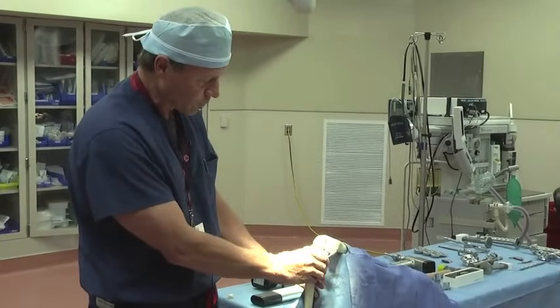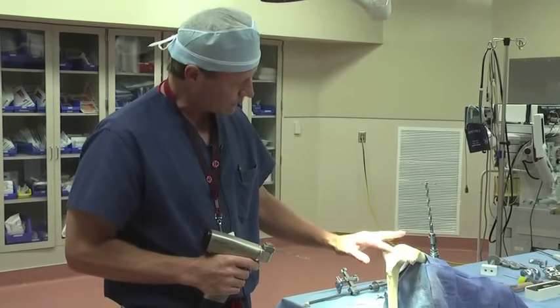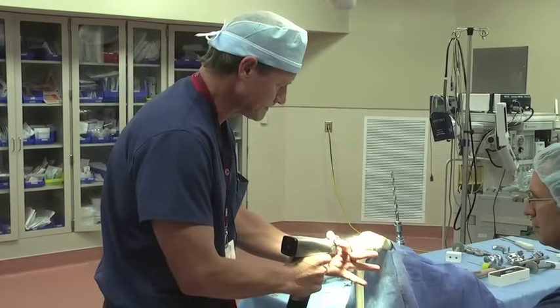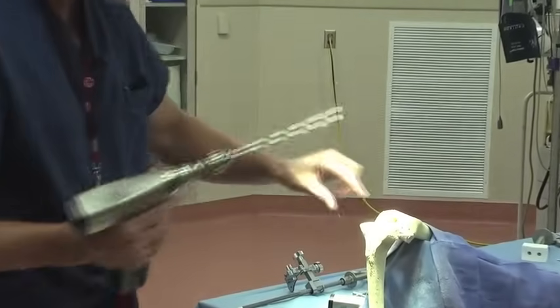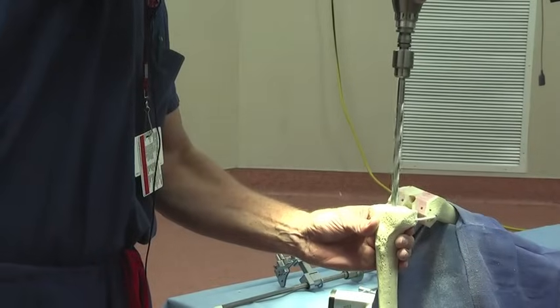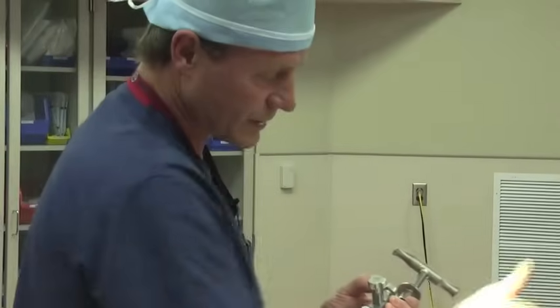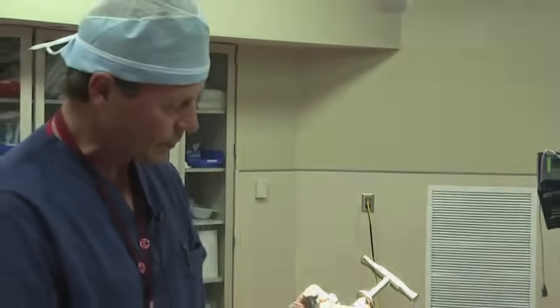We then bring the tibia forward and start to prepare that. As a personal preference, I like to take off the tibial spines to make it flat so I can drill the next hole. Now working on the tibial side, once I have a good flat surface, we'll come in and put our drill in again for a rod. We'll use an intramedullary rod — you can do this with an extramedullary rod, but I prefer rods that go down the bone for a better read on alignment.